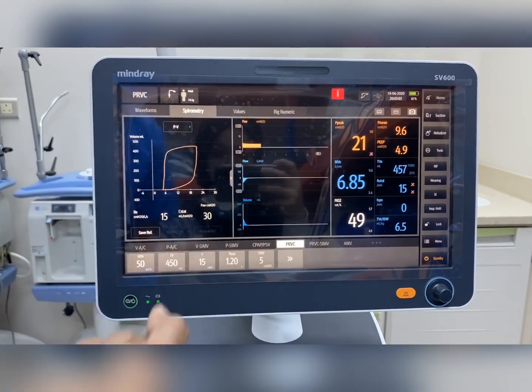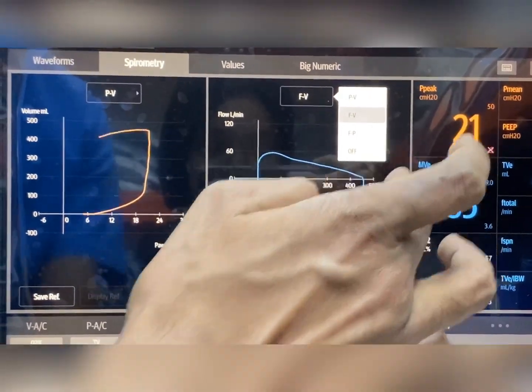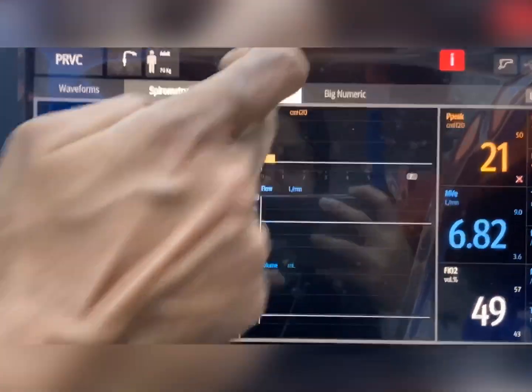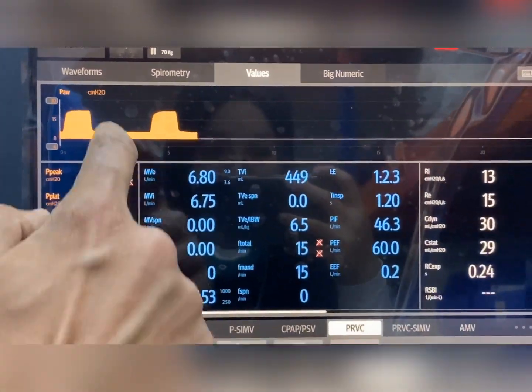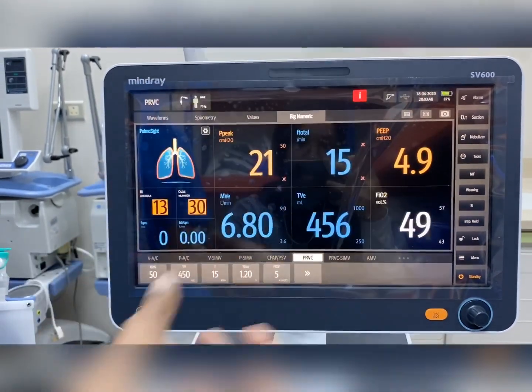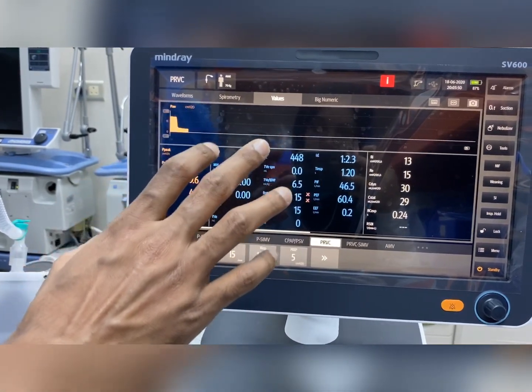From the spirometry screen, we can see the pressure-volume loop. If you want to see more loops, options like flow-volume, pressure-volume, and flow-pressure are available. Whatever loop you want to see from spirometry, it can be viewed here. Another option from the machine is the values display — you can see all values on a large screen with pressure waveforms. There is also a big numeric option so the main parameters are shown prominently, along with how the lungs are functioning with ventilator delivery. These are the basic things about the ventilator.